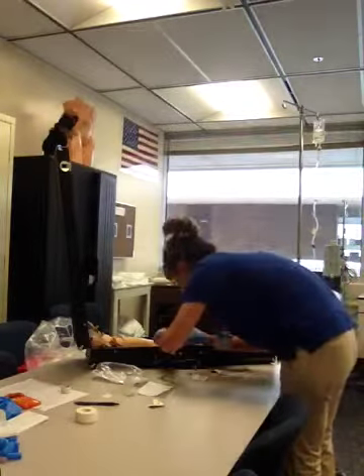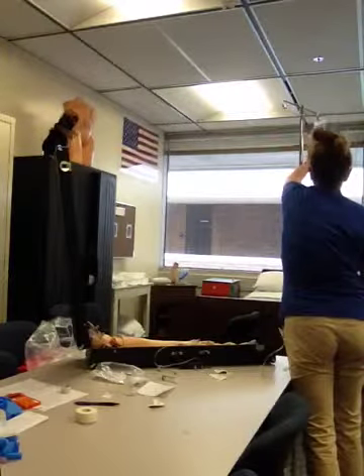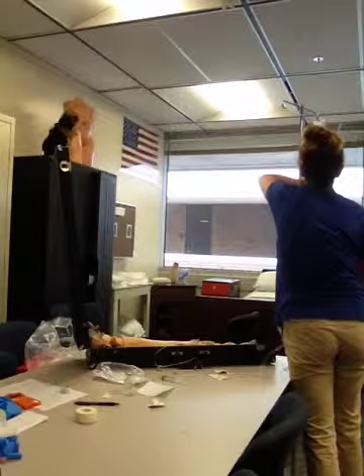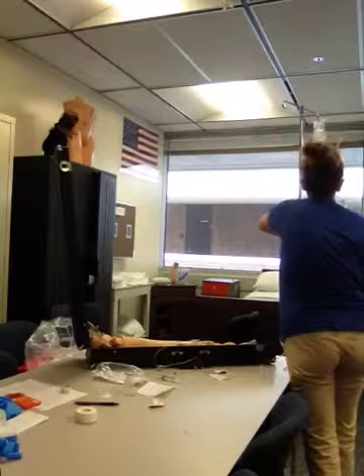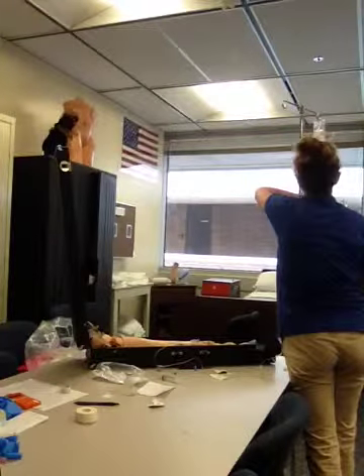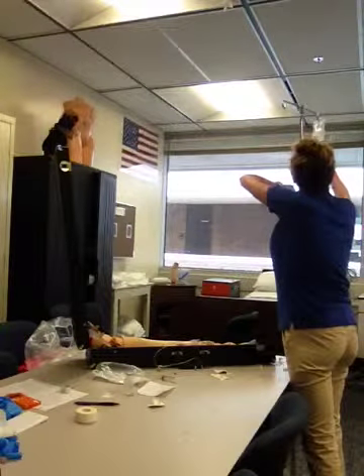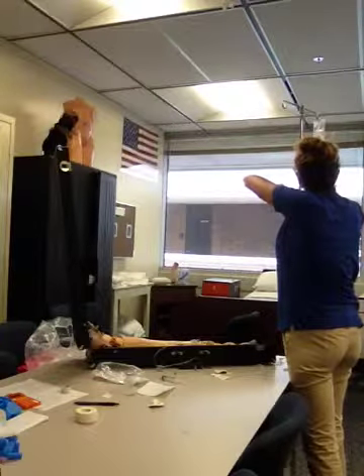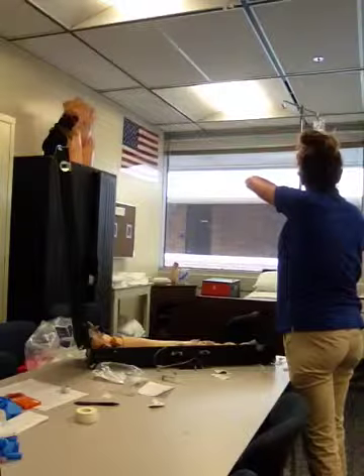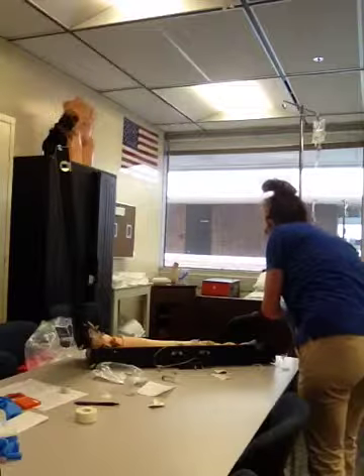Infusion. At this point, I can see the blood flowing. And I'm counting approximately 17 drops per minute. And we've got 17 drops per minute as a flow rate.